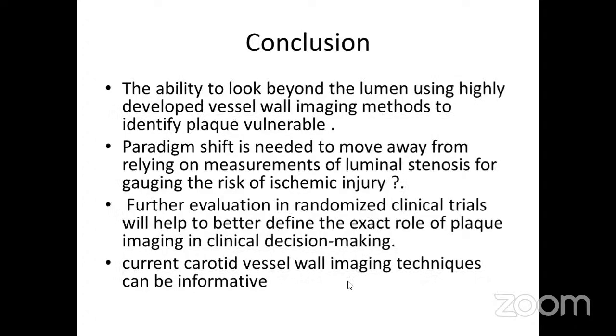The conclusion is that the ability to look beyond the lumen, using highly developed vessel wall imaging, is required to identify plaque that is vulnerable or not vulnerable. A paradigm shift is needed to move away from relying on luminal stenosis for gauging injury, toward plaque assessment for stratifying the risk for ischemic injury. Further evaluation in randomized control trials will help to better define the exact role of plaque imaging in clinical decision making. Current carotid vessel wall imaging techniques can be informative. Thank you.